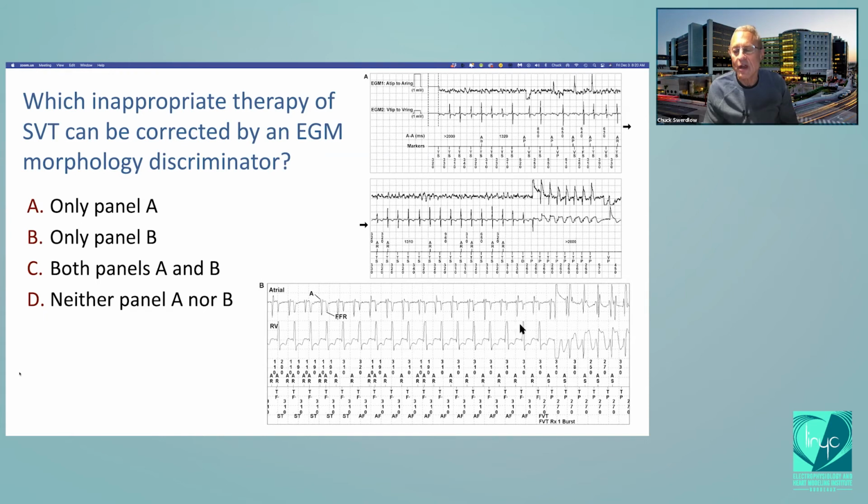Well, this is sinus tachycardia, right? This is a P wave. This is a QRS. What's this? We call this the far-field R wave. It always lines up with the R waves on the ventricular channel, and it is the representation of ventricular signal recorded on the atrial electrogram. It's not sensed here, but it is sensed here. So we call this intermittent oversensing: too many markers, more markers than P waves, intermittent atrial oversensing.